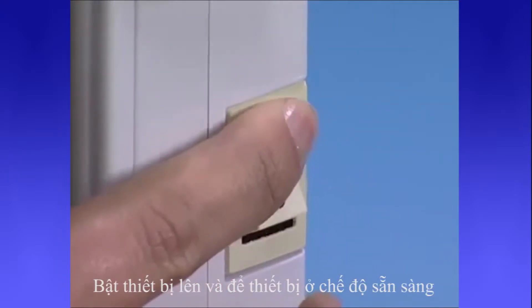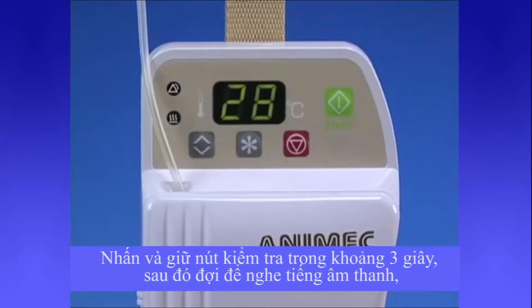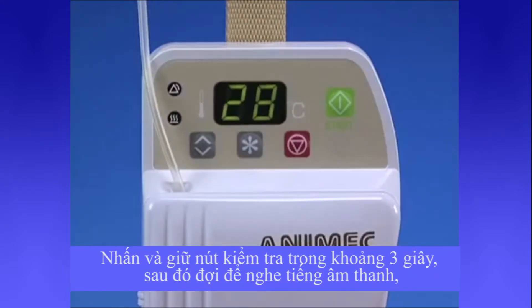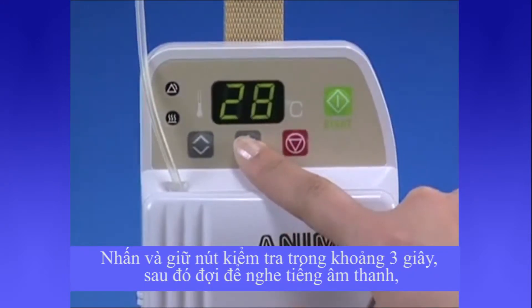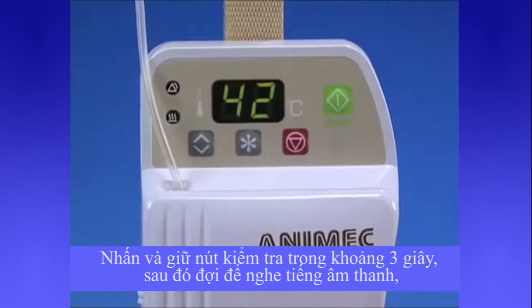Turn the device on and set to standby. Press and hold the check button for approximately 3 seconds. Listen for the sound, look for the light, and check that the display is at 42 degrees.